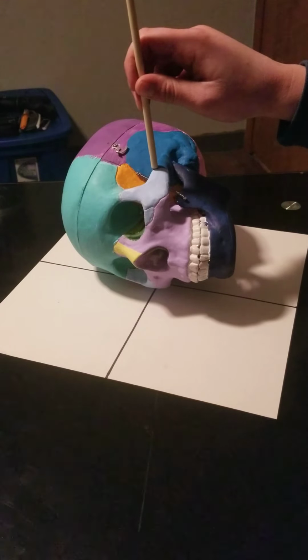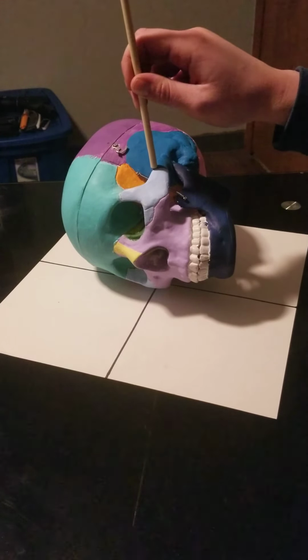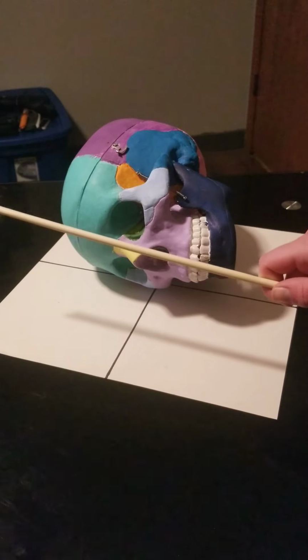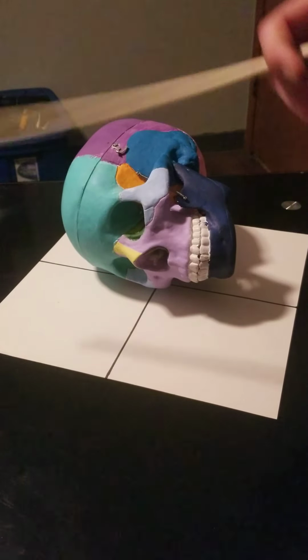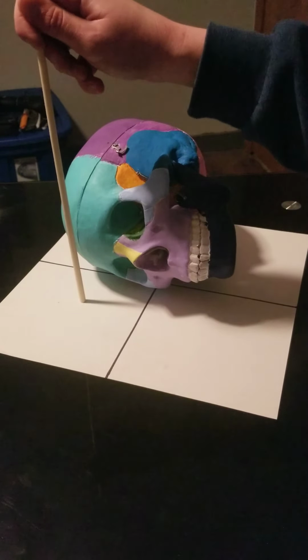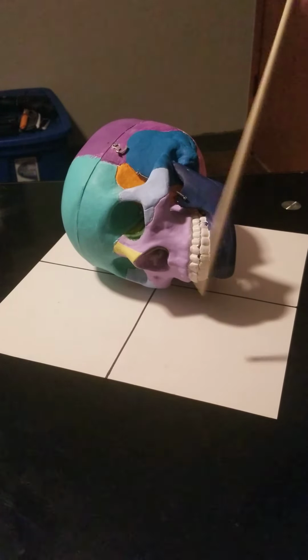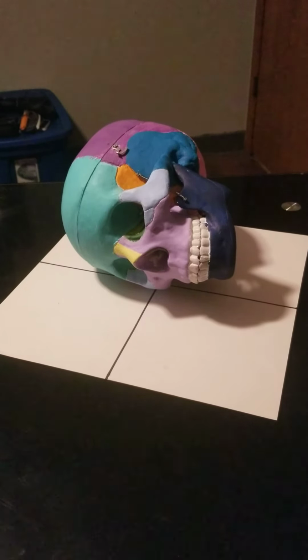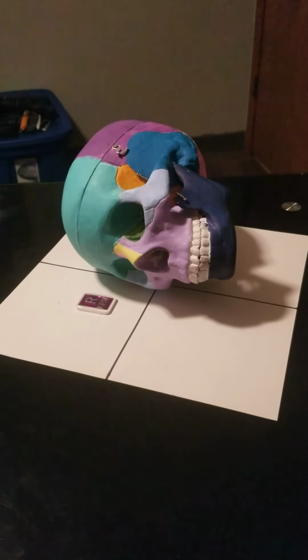And then I'd want my collimation to be a ½ inch beyond the shadow of the tip of the nose, superiorly above the supraorbital margins, and inferiorly to the gonion, and then posteriorly to the EAM. At this point, I would place my marker and expose.